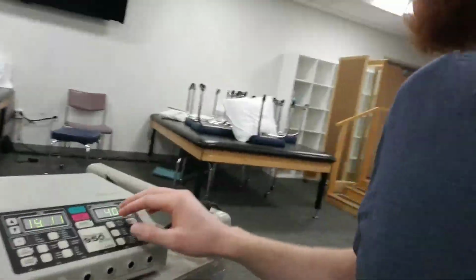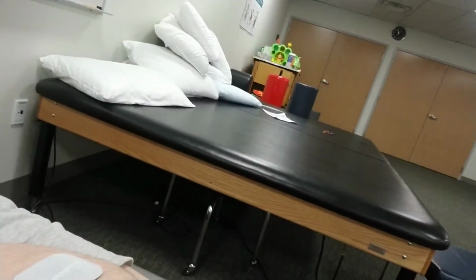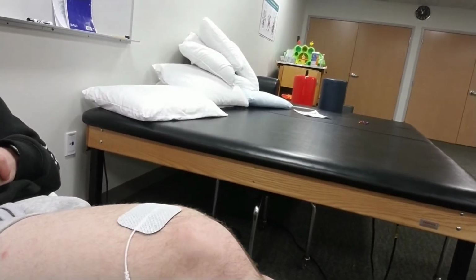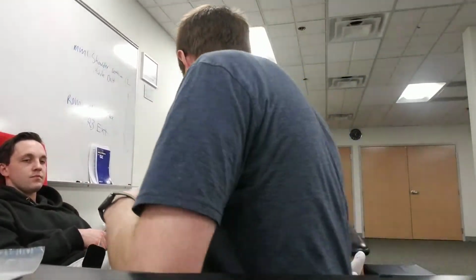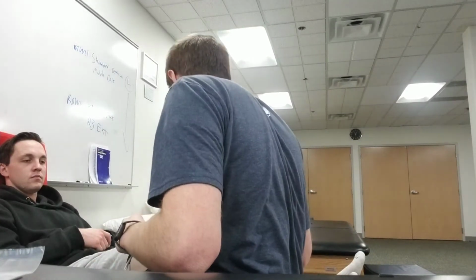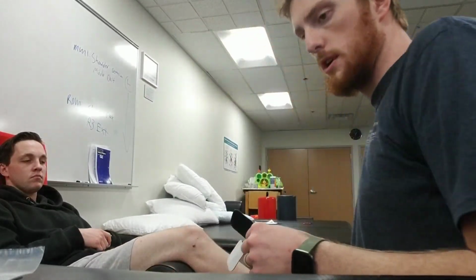Okay, awesome. So I'm gonna turn off the machine here. Turn all that off and take these pads off. Sorry, it might be a little painful, any leg movement can be uncomfortable. Okay, good. I'm going to put the camera back here. All right, let me look at that skin. All right, we got no redness. Is it painful at all? Do you feel any pain afterwards? Mm-mm. Okay, perfect. Exactly what we want.